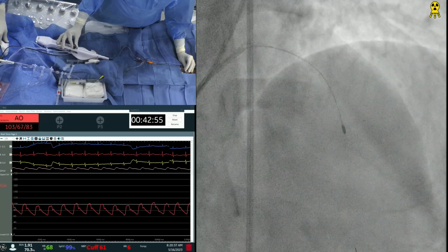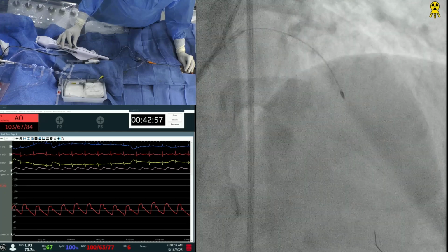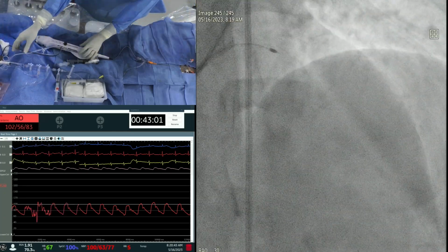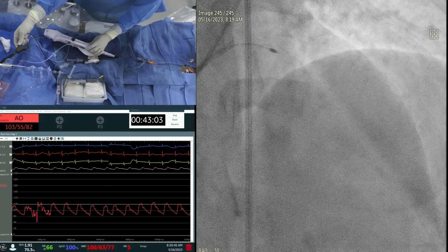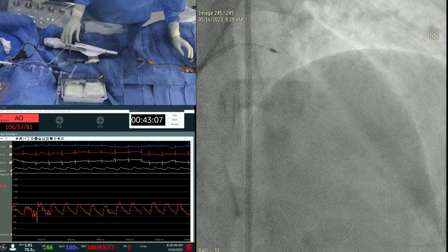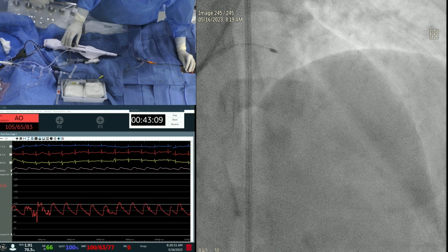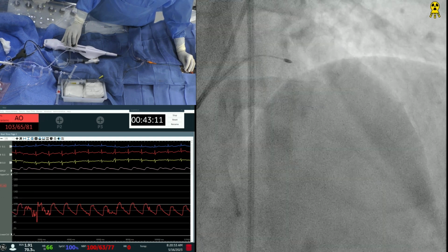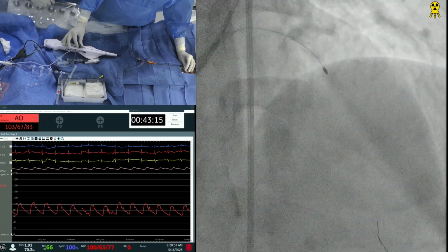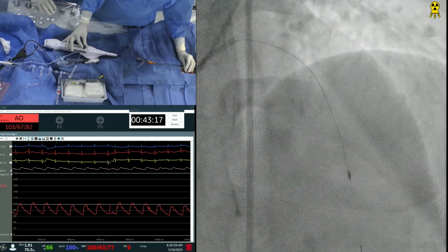And you just crossed it, I think. Yeah. Yep. One more polish or is it done? Okay, leave it. Total close to 2 minutes, yeah. Now we are just doing a polishing run. No, not that far. Okay.